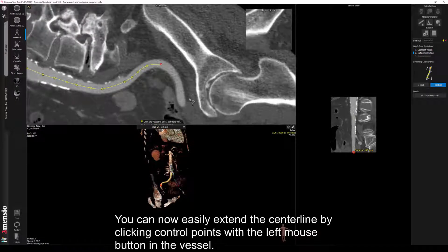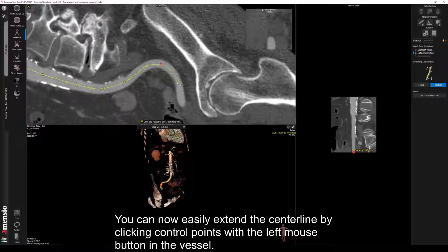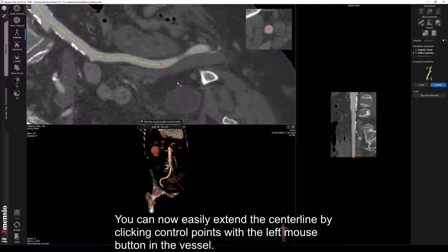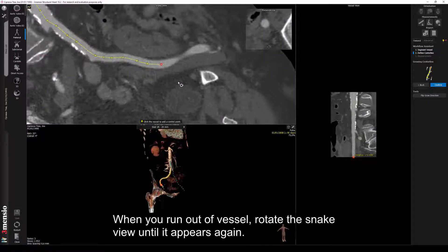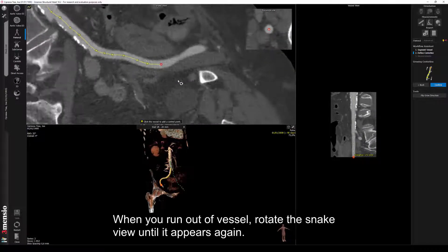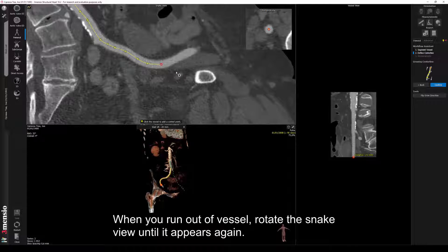You can now easily extend the centerline by clicking control points with the left mouse button in the vessel. When you run out of a vessel, rotate the snake view until it appears again.